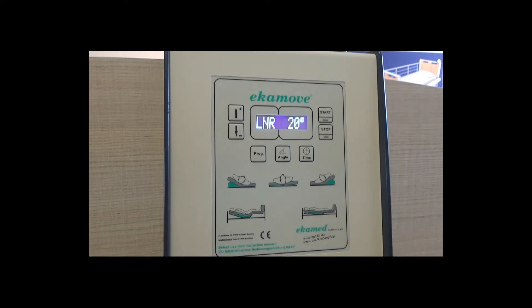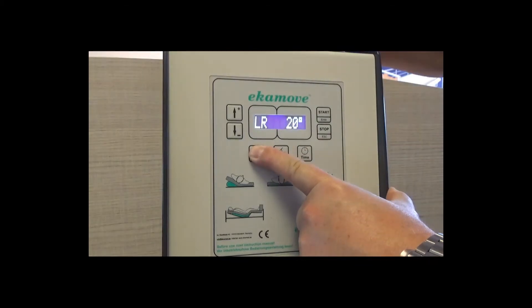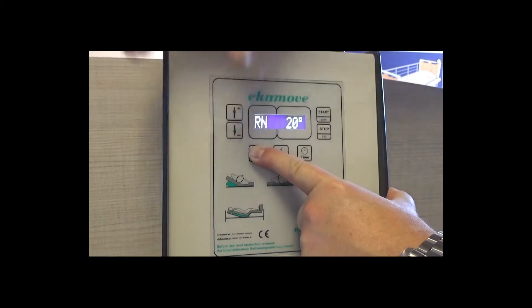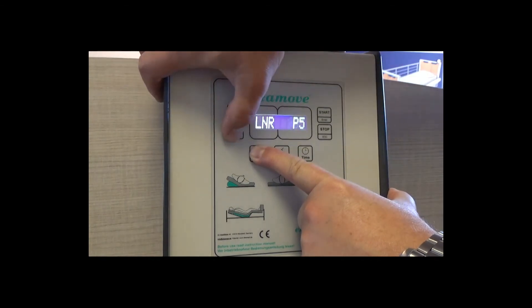There are other program options: LR (left and right turns, eliminating neutral); LN (left turn and neutral, eliminating right); RN (right turn and neutral, eliminating left); and P5, a specialist program for complex needs.